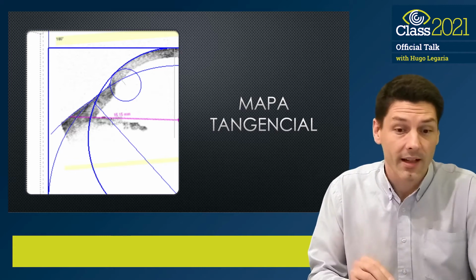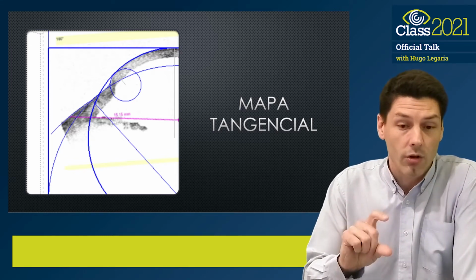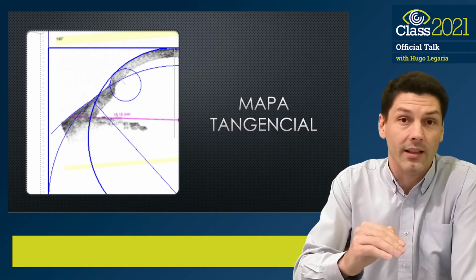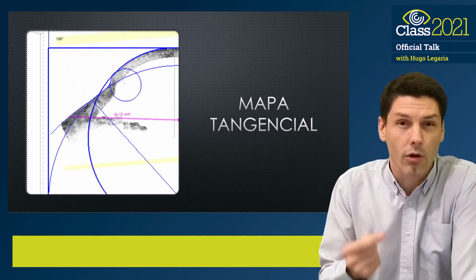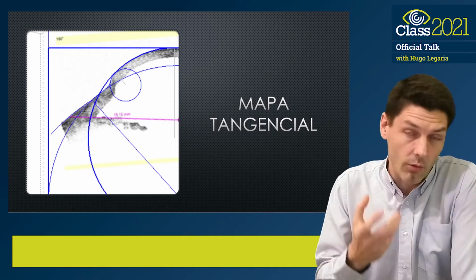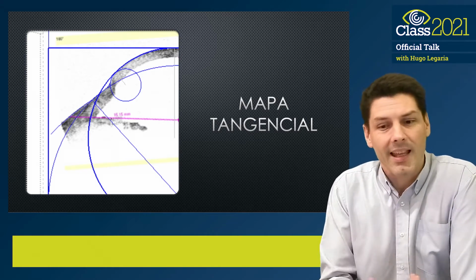And it represents very well how the cornea closes, where the end of the graft is located. We will see that in detail in the topography with very warm colors, precisely representing a very closed radius of curvature that in an axial topography cannot be seen.